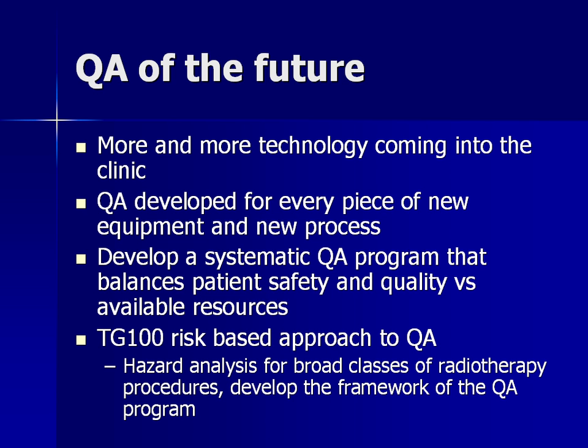What's the probability that this is going to happen? What are the consequences? How much? What's the cost of the consequences versus the amount of resources required to do the QA procedure? And the bottom line of the particular paper was that our standard QA procedures are cost justifiable, but it certainly provided a framework for doing this kind of risk analysis.